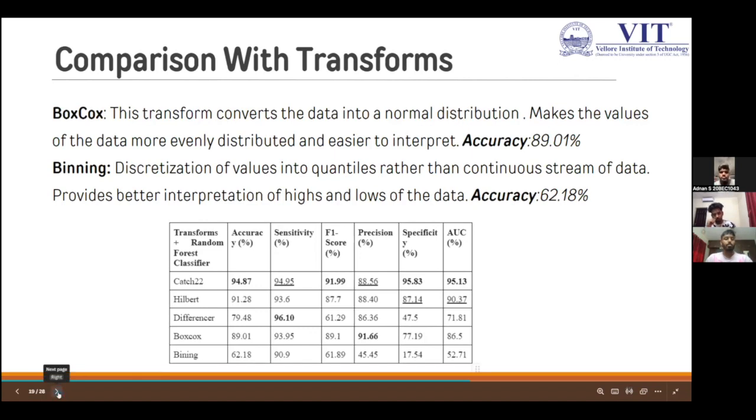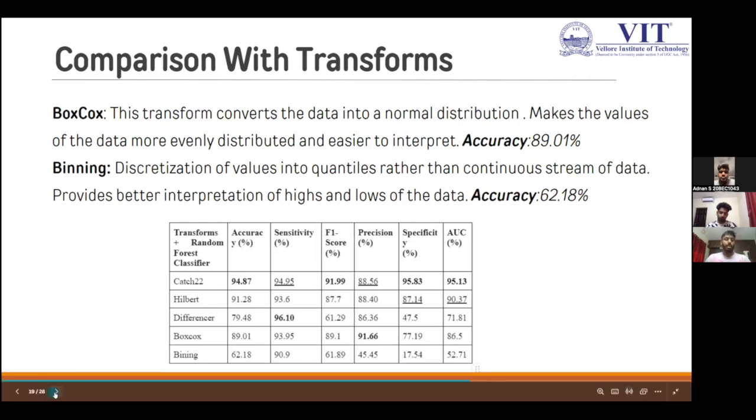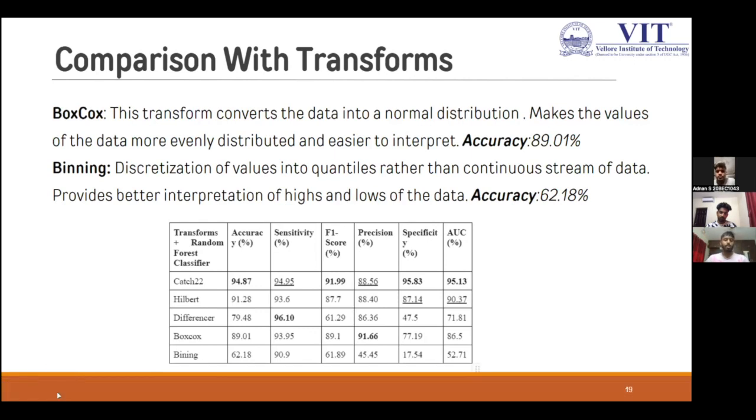Similarly, the binning discretizes a continuous waveform. So we have a continuous time series signal, and this signal will be discretized by changing it into 0s, 1s, and minus 1s, or 0s, 1s, and 2s based on the location of the value. This will make it easier for the model to understand, because there are only three unique values, which are just lows, highs, and mids.